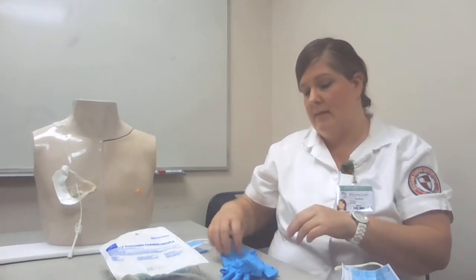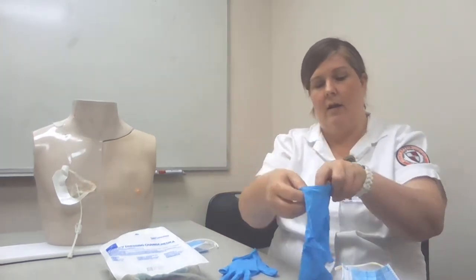I'm here today to do a CVC dressing change. First, I'm going to verify the physician orders and gather my equipment. I'm going to identify my patient against the patient's armband. Next, I'm going to identify any allergies the patient may have. Then I'm going to wash my hands and don my clean gloves.